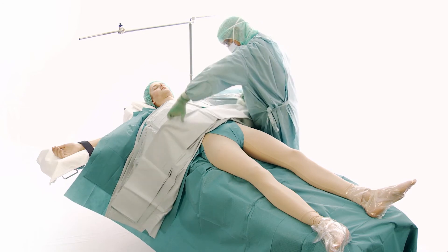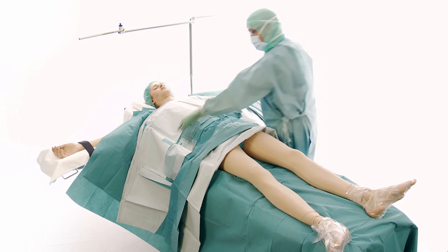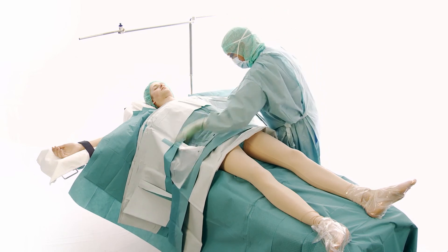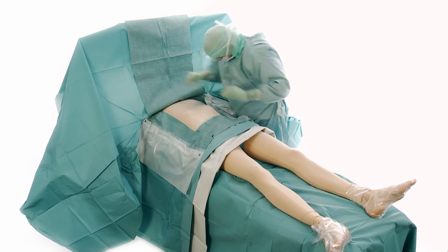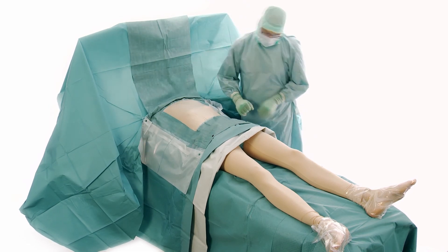Unfold the drape only once towards the feet. Keep legs free to enable possible removal of vena safena magna. Unfold the drape fully towards the head. When appropriate, unfold fully towards the feet.